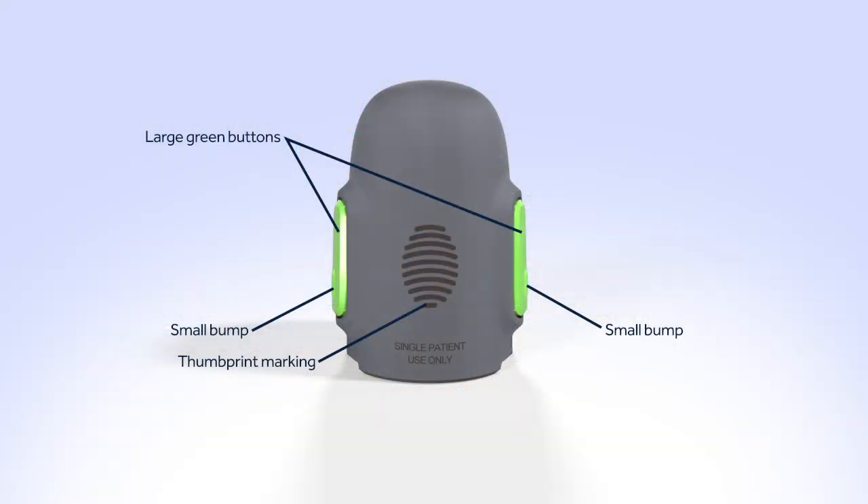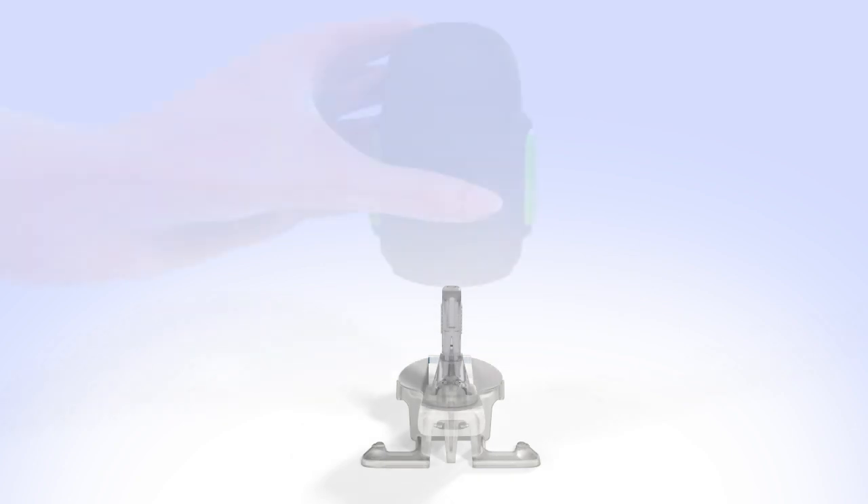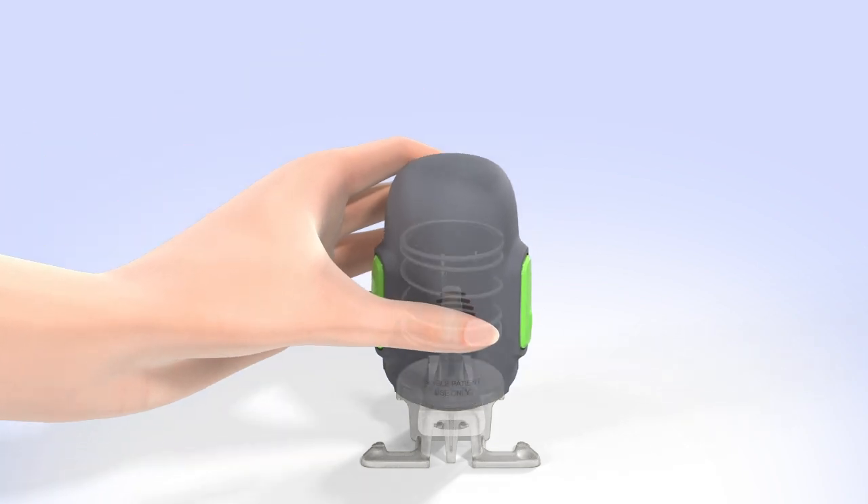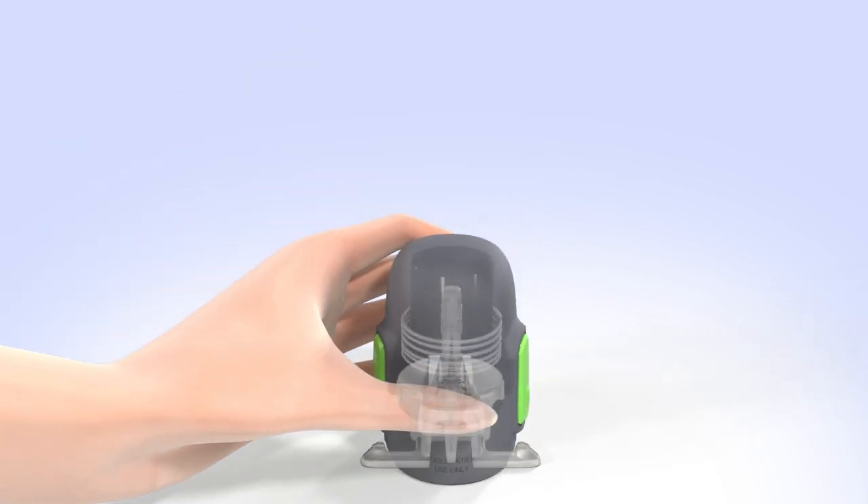Now let's take a look at the Serter. Hold the Serter so your thumb is on the thumbprint. Be sure your fingers are not touching the green buttons on either side of the Serter. Carefully push the Serter down onto the sensor and pedestal until the base of the Serter sits flat on the table and you hear a click.